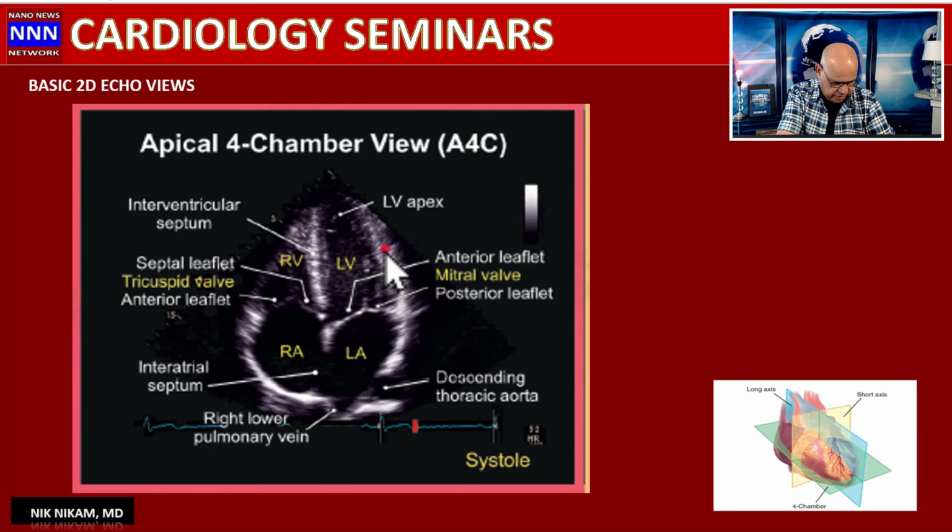So this is going like this one, fanning through the entire width of the heart, from this end to this end, and this is going from the apex. The transducer is here. Now the closest part to the transducer is the apex of the ventricles, and here we have the left ventricle recognized by the thick muscle and the distinct papillary muscles, and to the right we have the right ventricle. Here is the tricuspid valve, here's the right atrium, and here we have the left atrium.